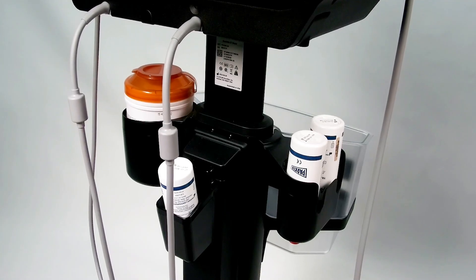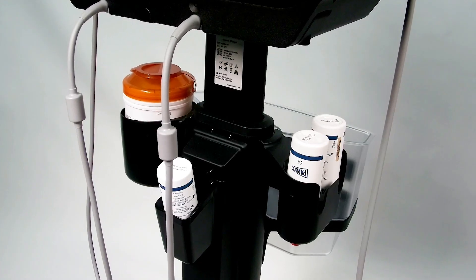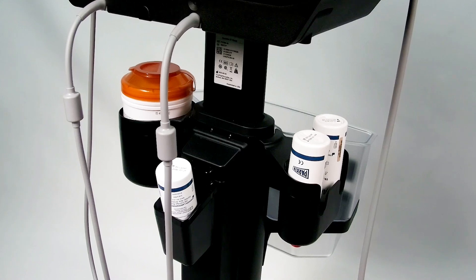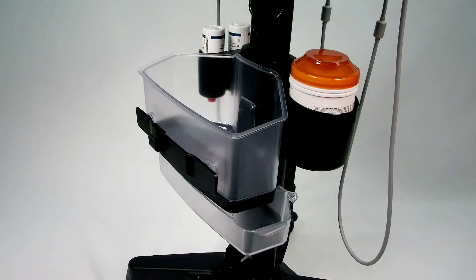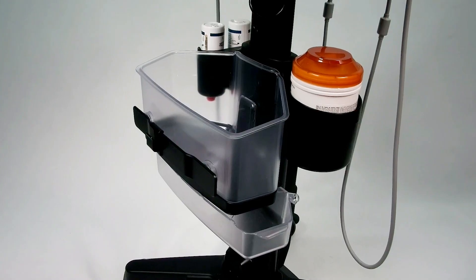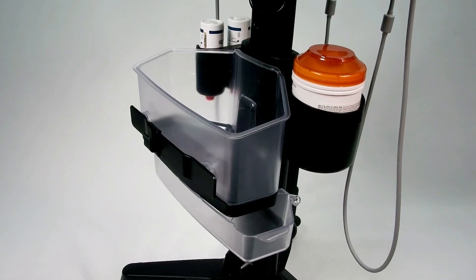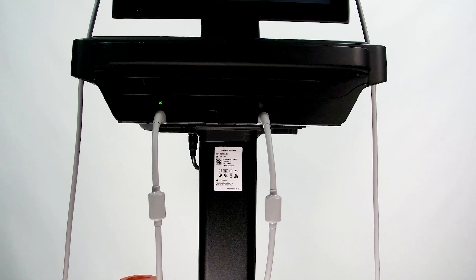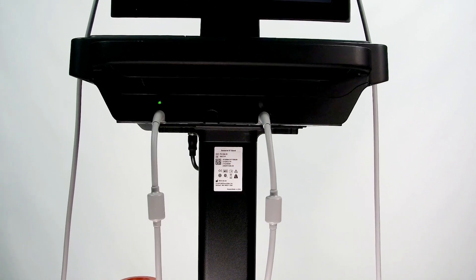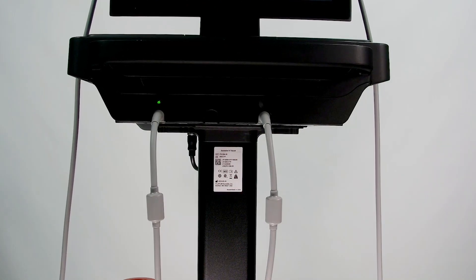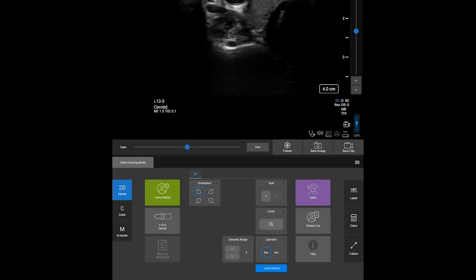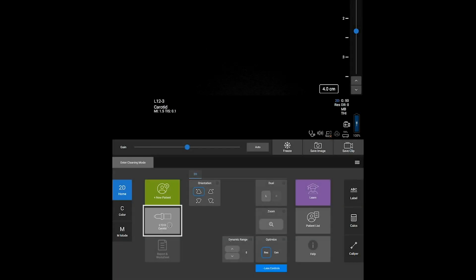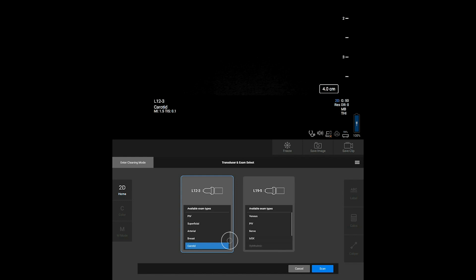The full-featured stand gives you everything you need at your fingertips, including storage, gel and wipe holders, and dual transducer connectivity, which allows you to install up to two transducers. You can switch between the two transducers at any time. Switching exam types is just as simple.